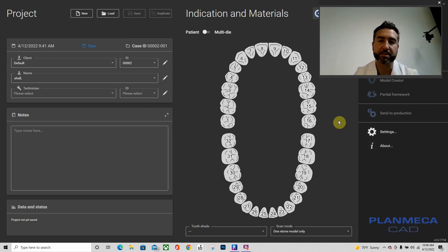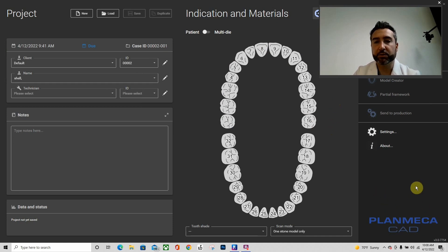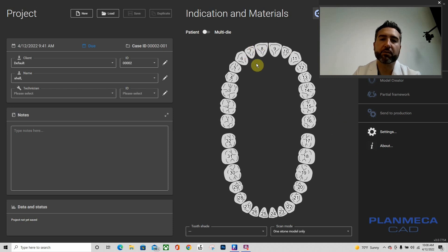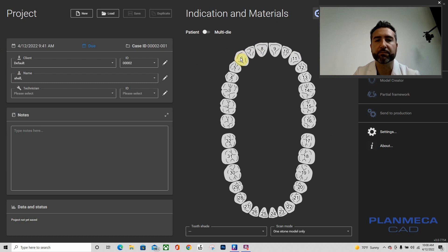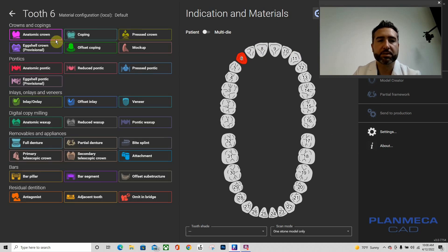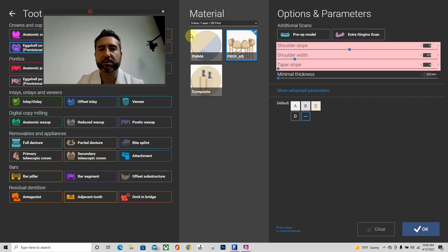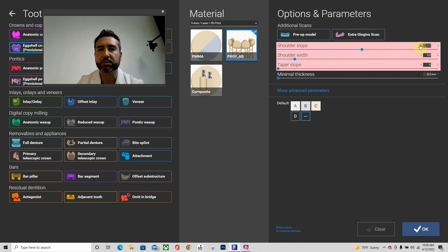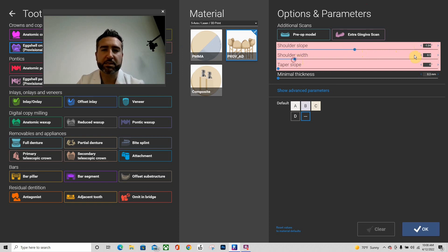Let's go ahead and get started here. Default client, I'm going to name this patient shell. I'm going to click on tooth number six here and go to eggshell crown 3D print. I'm going to change my default here: slope shoulder, let's just go ahead and call it negative one. Shoulder width 0.3, the default is 0.5, and taper slope 0, minimum thickness 0.3, and hit okay.